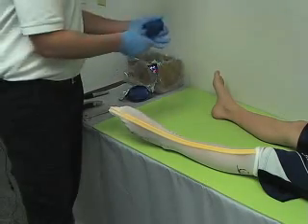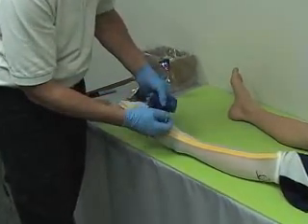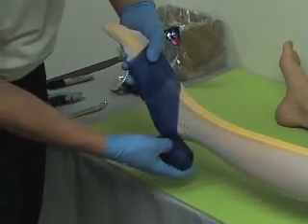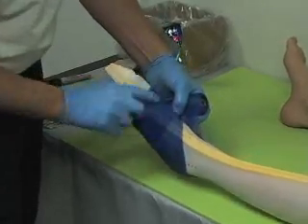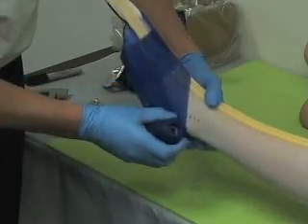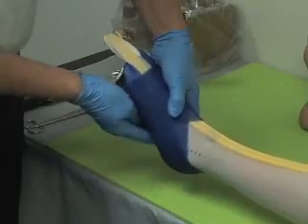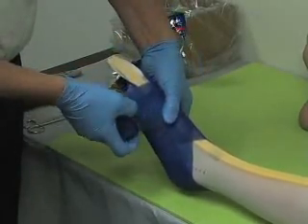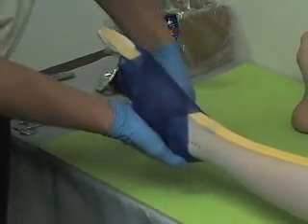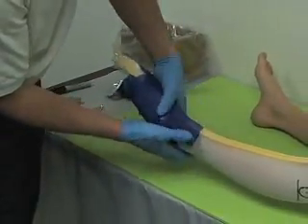To begin rolling the fiberglass, it is important to start at the ball and go around. If you are using a soft cast, twice around. If you are using a firm cast, once around. We are then going to go down around the heel and up around the toe — once on a firm cast, twice on a soft cast material. This casting technique was developed over a custom shoe casting technique. It allows us to get the intimate profile of the toes, so when you go to fit your orthosis, there is very little work on your end as far as adjusting and fine tuning. And we just continue wrapping up the foot.